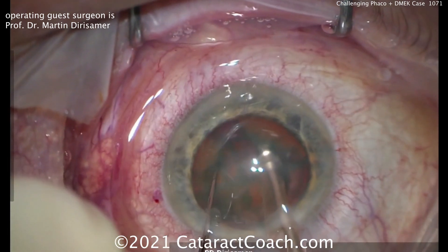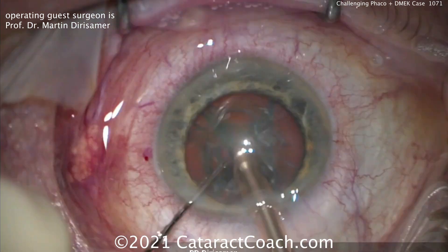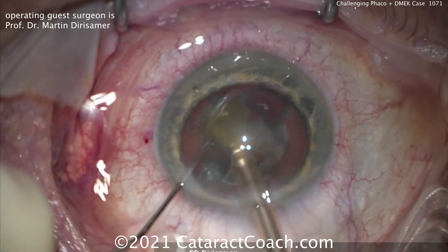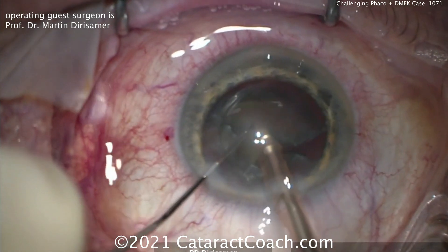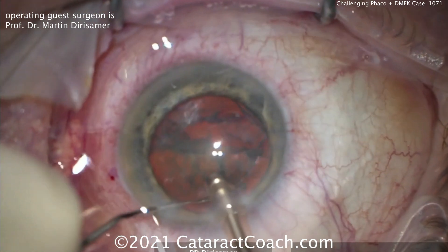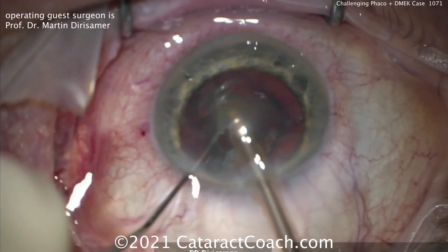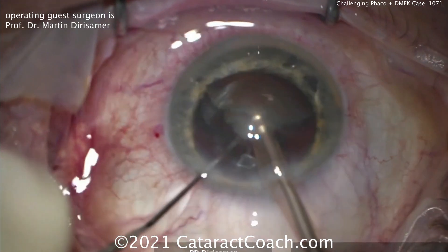We won't bore you too much with just showing the cataract surgery, because the interesting part here is the management of the DMEK graft. Dr. Dirisamer has come up with techniques we use very routinely to open up our grafts. His technique for unrolling a graft is genius, and I've been learning DMEK over the last couple of years.